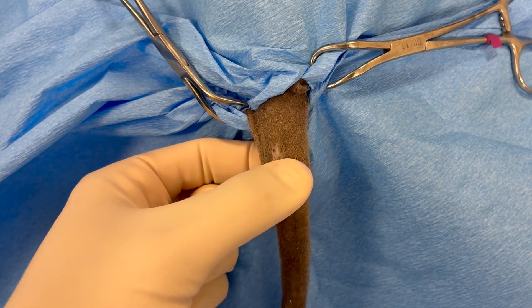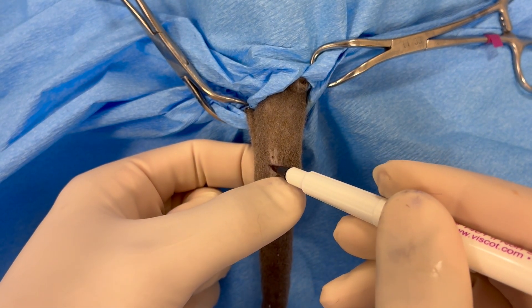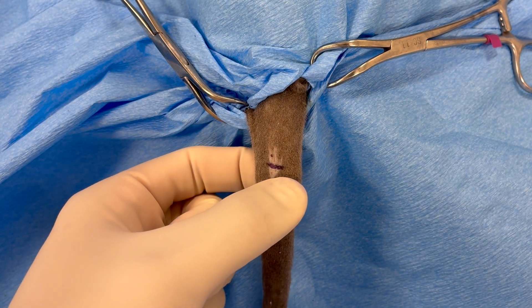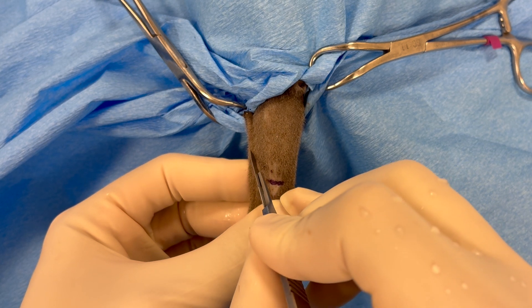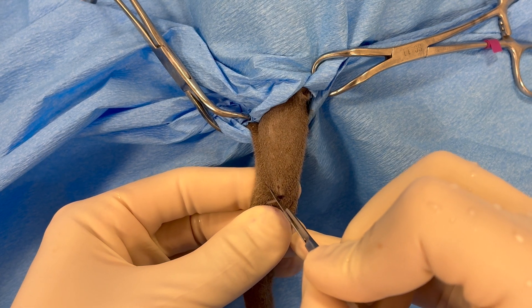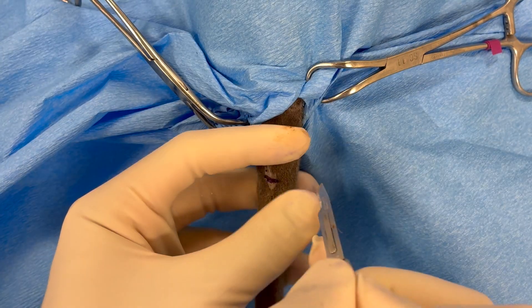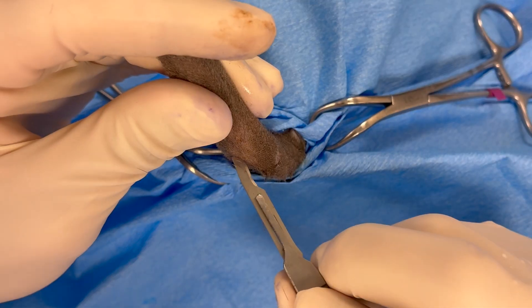The entire tail is aseptically prepared and draped off. The level of the amputation is determined by the extent of the disease and desired margins, and a U-shaped or V-shaped incision is made through the skin both dorsally and ventrally.